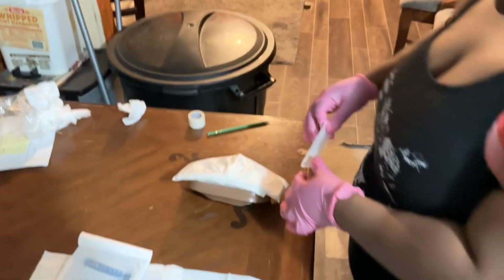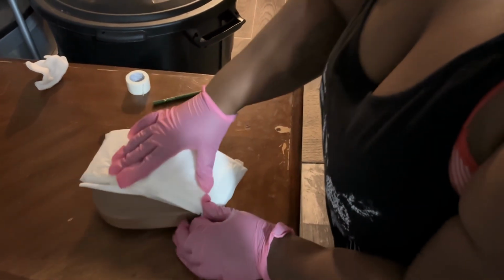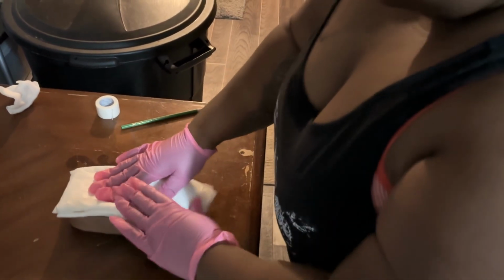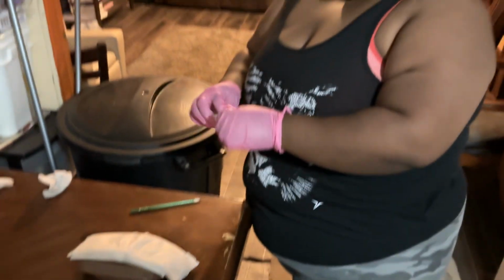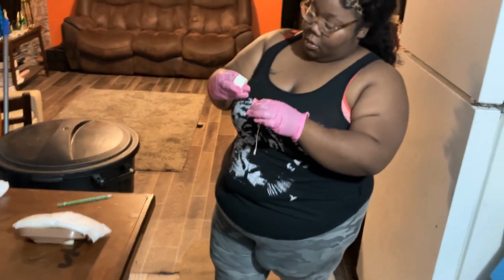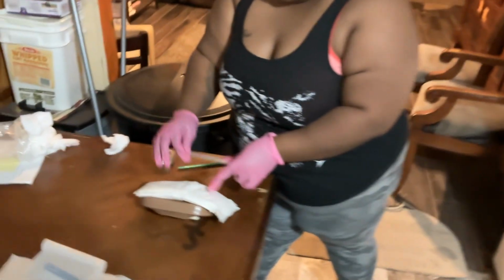Like I said, it's kind of hard to do this because this ABD pad is way bigger than this dressing. But I would tape my bottom piece as well. My side piece as well.